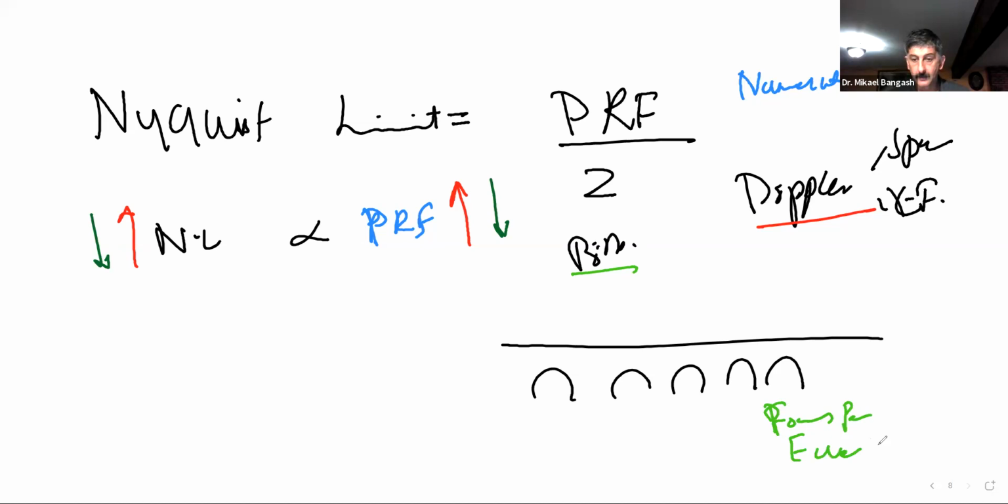and focus number, in Doppler is going to change to become what we call PRF. And another function that we'll talk about later on is the wall filter.